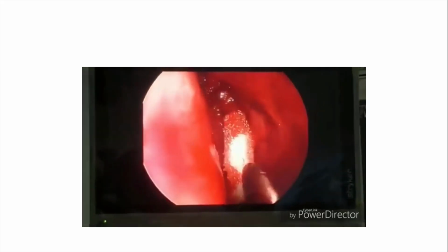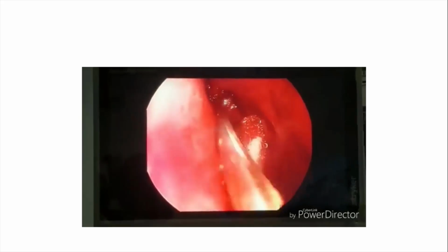So this is the exposure. Thank you. First, the aim. The aim is the exposure of the sac, then nasolacrimal duct identification, and the incision made in the sac exactly, making it into two flaps, medial based and lateral based. The medial based flap is excised completely in order to keep the sac syringing part visible. Then followed by periodic follow-up and endoscopic examination, and proper follow-up as well as syringing.